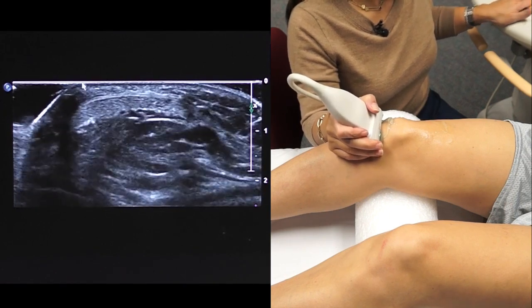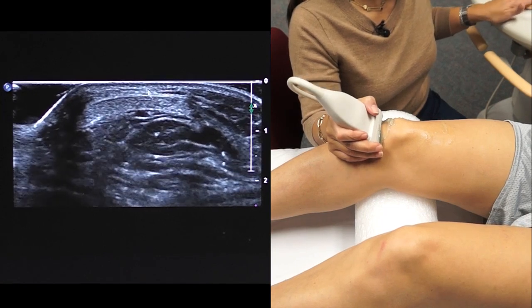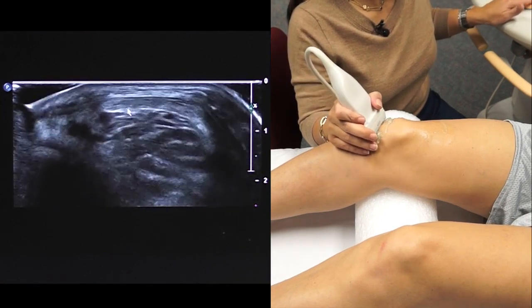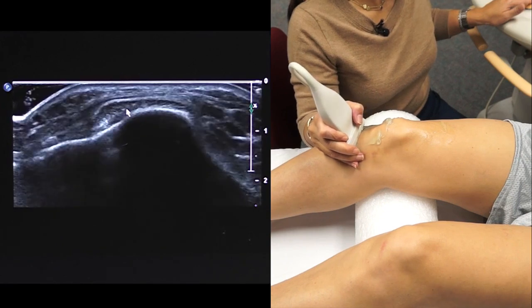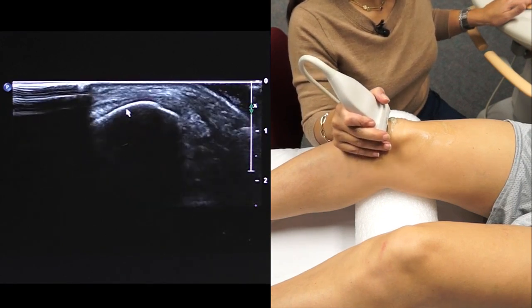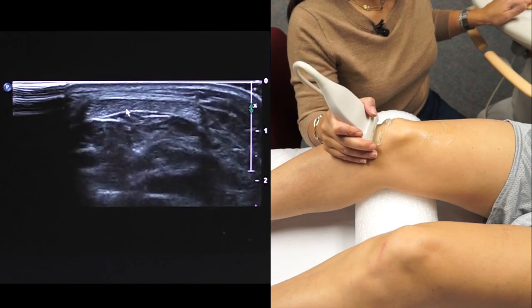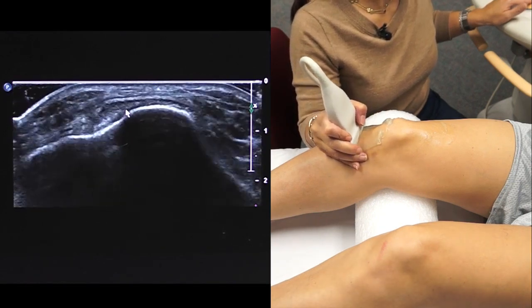And so if you're only scanning in this location in long axis, you may miss pathology that is in this location. So you want to make sure that you image it in two views, but also that you sweep from side to side. And you move from the most cranial aspect, and you keep scanning it till the most caudal aspect at its insertion.